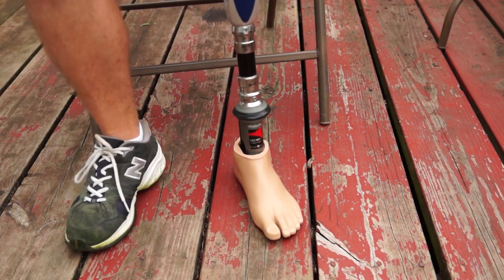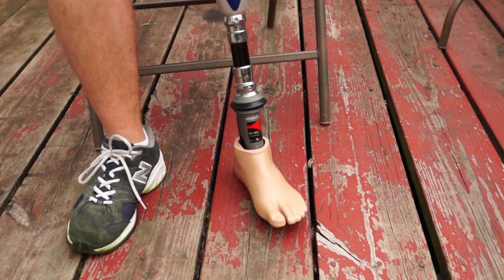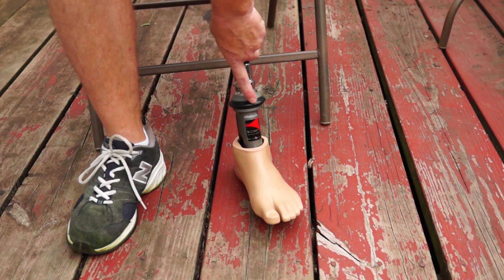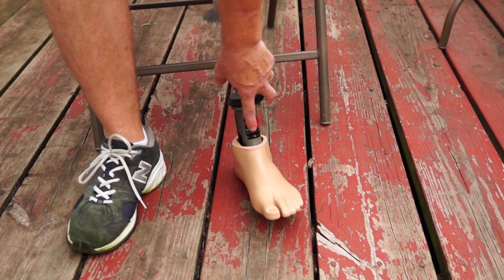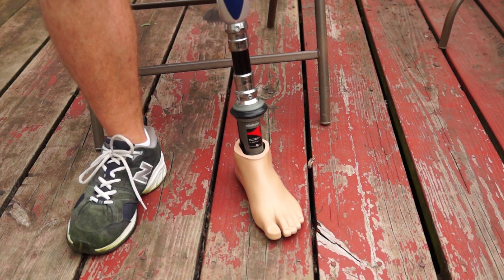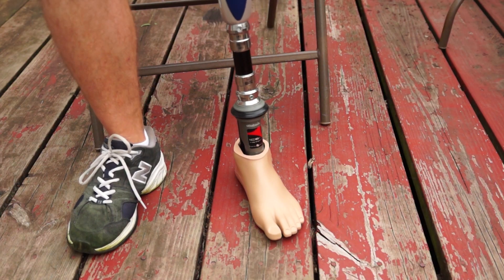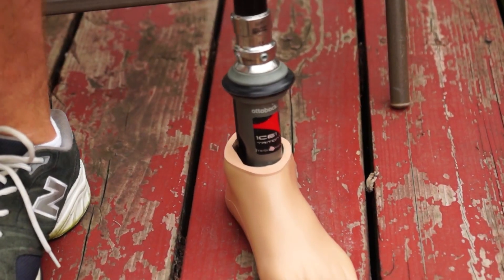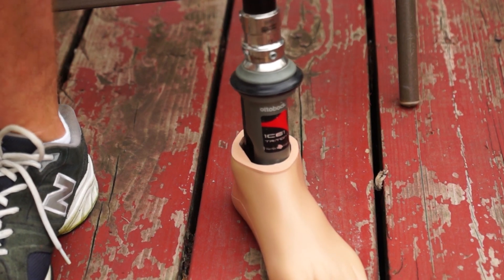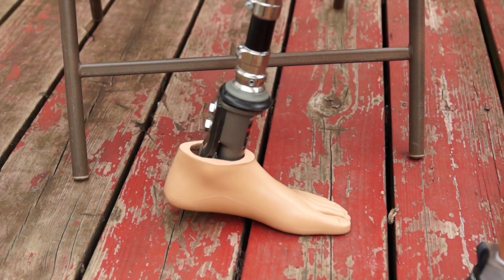My foot is an Ottobock Triton foot and it's got vertical shock in it. If you look at this ring, this is pretty much all my vertical shock. When I'm actually putting weight down on it you can see it compress, and it takes most of the shock away from my residual limb whenever I'm taking a step. See how it kind of bounces a little bit?